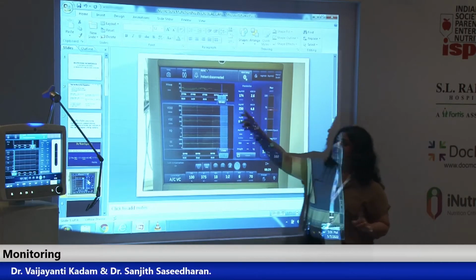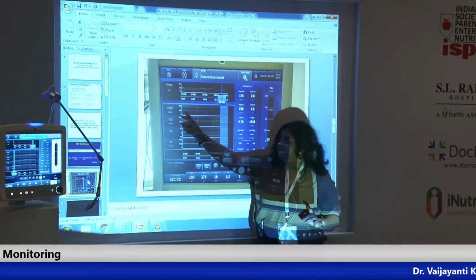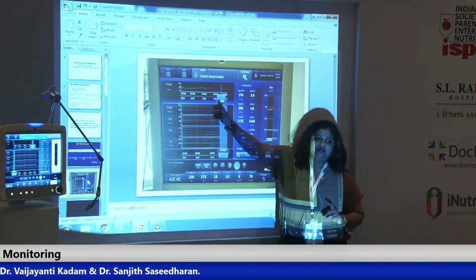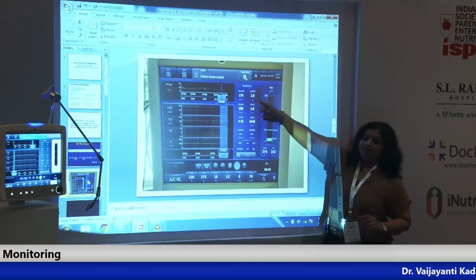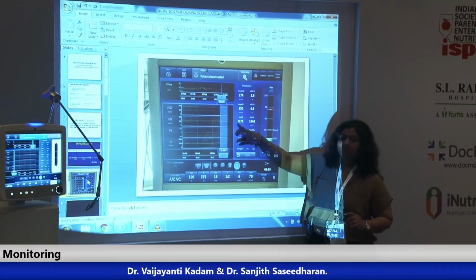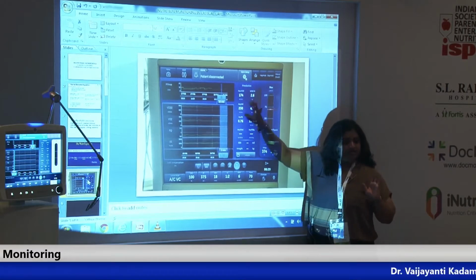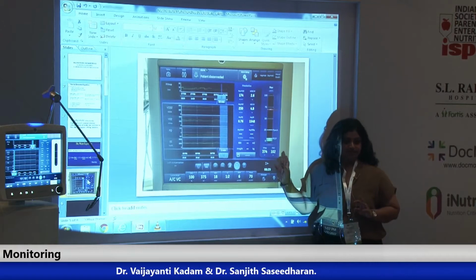Therefore this window is kept. Why is this window of interval there? Because I will keep searching for a steady state. These values will keep changing when I move my cursor here. At one point my values will come below 5%, VO2, VCO2, and RQ will be 0.8 or 0.7. Clear? Once I get this reading, I will get my energy expenditure.